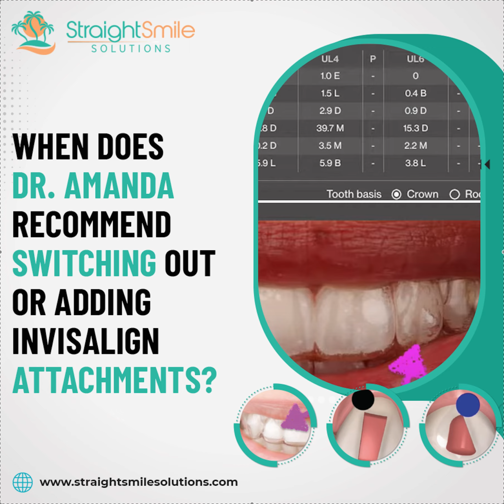You guys know that if you listen to my videos, double it, either double or 2.5, make it a lot longer. That slows down the movements per aligner, makes it way more predictable. Then I also double check the bite at the end. Then I'm going to go in and double check.